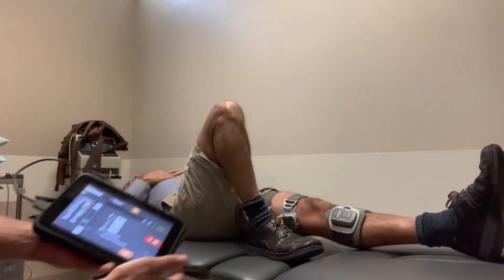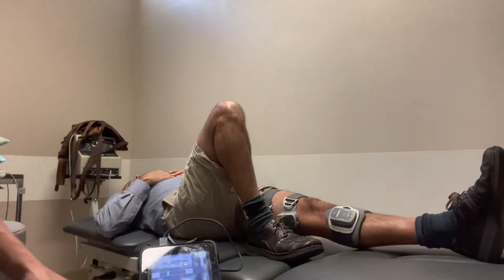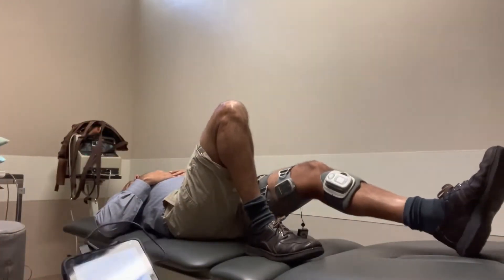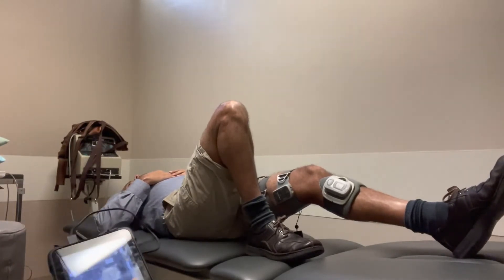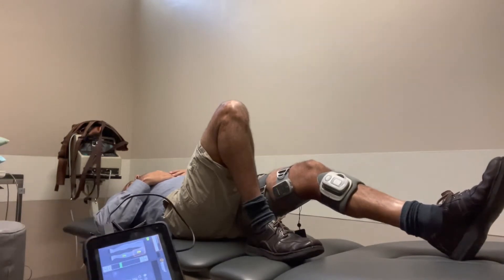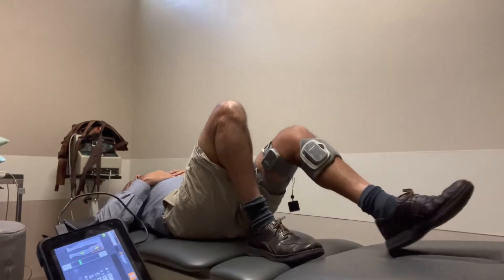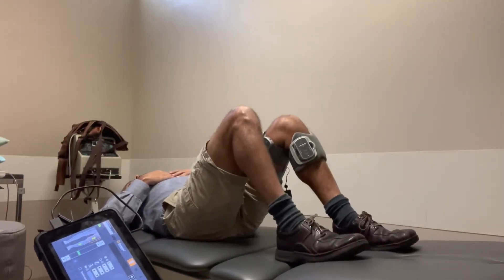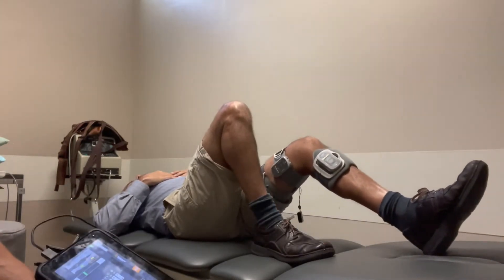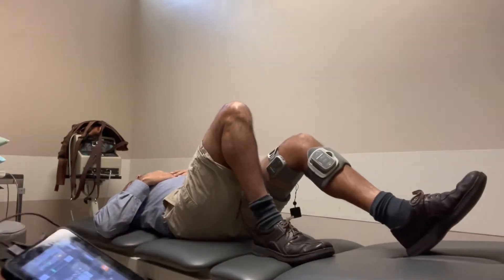We're going to activate it — here are hamstring sets. Depending on what angle of knee flexion you need, the patient digs their heel into the table. For a more isotonic approach, we go to heel slides next. Every time the patient feels the stimulation on, you may need to lower the intensity a little bit just to allow full range of motion.